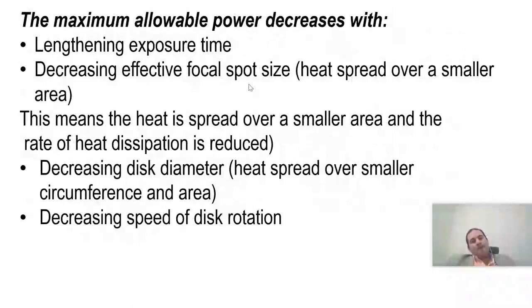Okay, but we remove the option for the anode angle. This also depends on the type of your machine. But if we say now that let's fix all the factors, and now I will reduce the focal size. So you are a user of this particular system and you have decided to reduce the focal spot size. What will happen to the power output of the system as a result of this change? Will you choose to reduce it further or increase it instead? Great, you decided to reduce it.